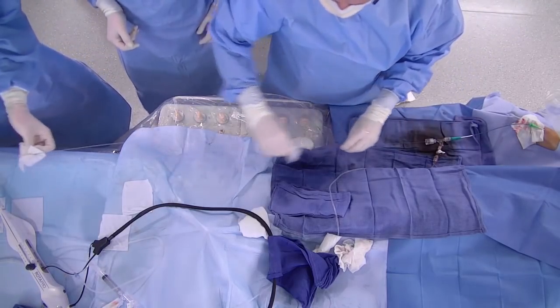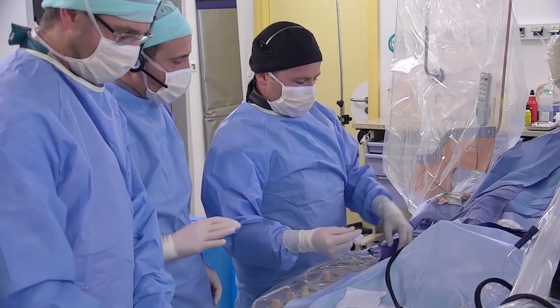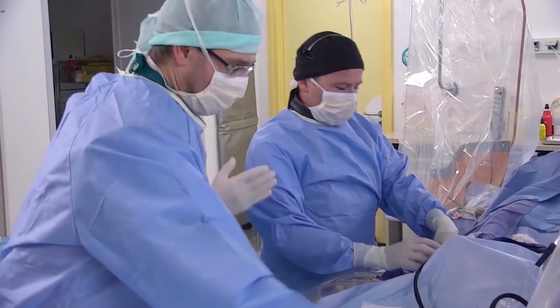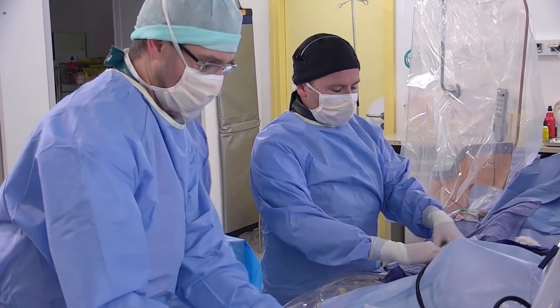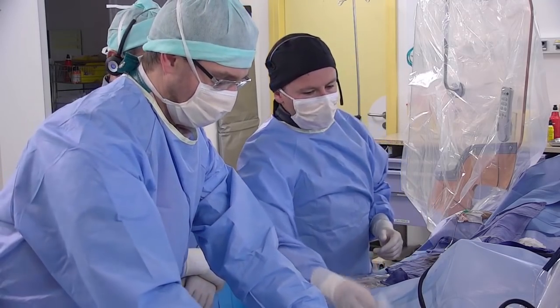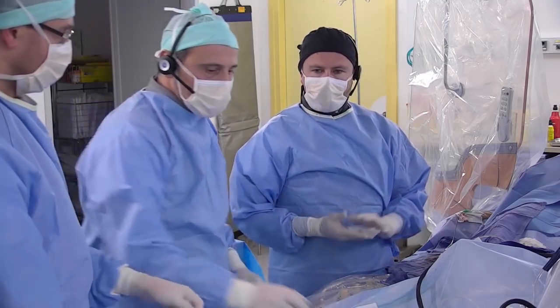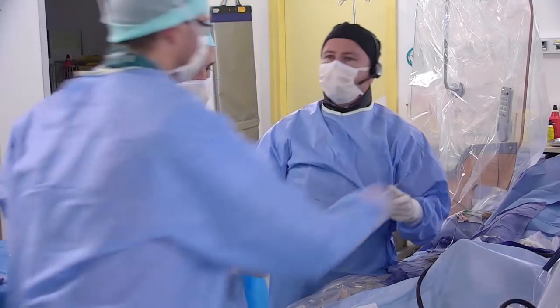And then I will place my workhorse wire inside the LAD. So the decision is to stop with 1.5 millimeter, right? I think it's okay because there is not a lot of friction in the distal part. And it was not so difficult to cross this lesion. This is my opinion, that the lesion is well prepared. Samurai, please.